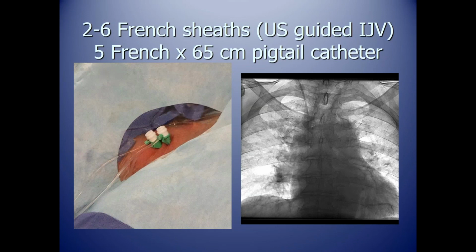And so here, this is what we do. This shows that over 80% of the patients that we treat have bilateral PEs. We stagger two 6 French sheaths in the jugular vein, again with ultrasound guidance for both accesses. The reason we like to use jugular access is twofold. One is that when you do a jugular access, the patient can sit up when they're in the ICU getting the infusion. Since a lot of these patients are short of breath, they feel very comfortable sitting up as opposed to lying down, as they typically would with a femoral vein access. And so that's very comfortable.